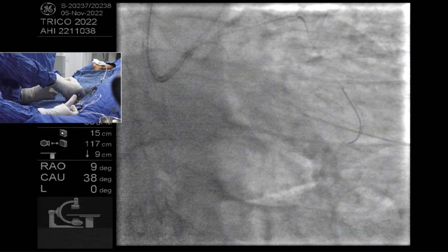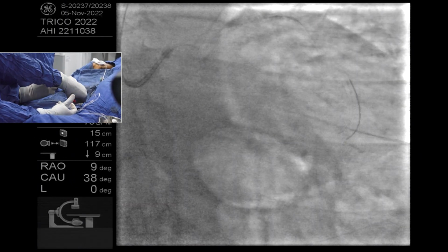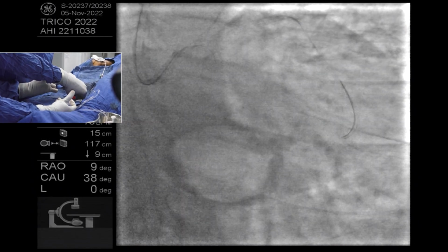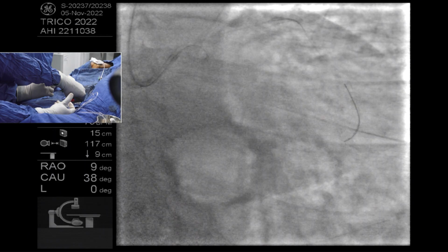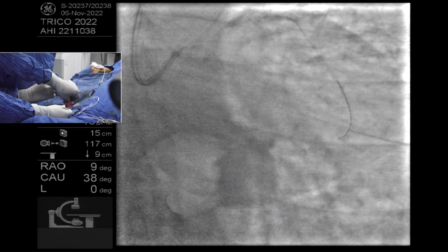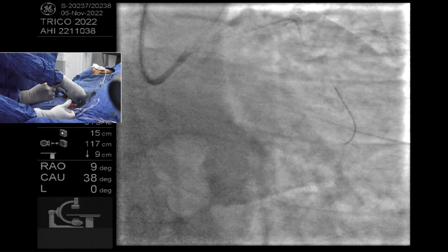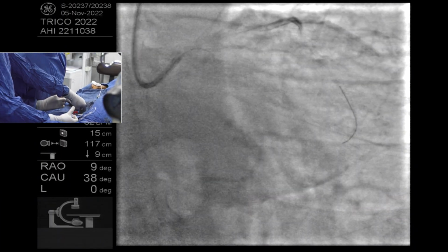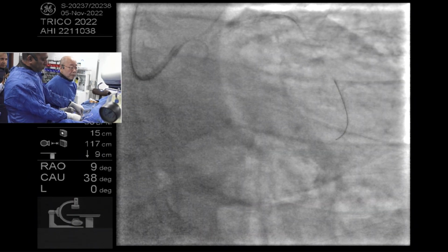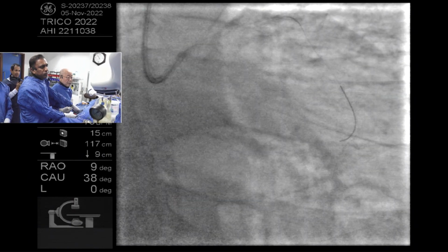I see. Sir, do you think a single lumen microcatheter will help straighten out the proximal problem? Yes, I'm thinking that. Shall we see what single lumen microcatheters we have? Yeah. We are also thinking, what microcatheters do we have? Single microcatheter, Fine Cross? Usually if you ask for other equipment, then the wire will go. So this is a blessing.